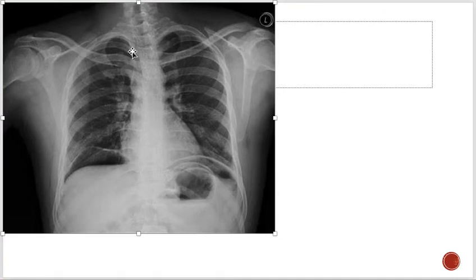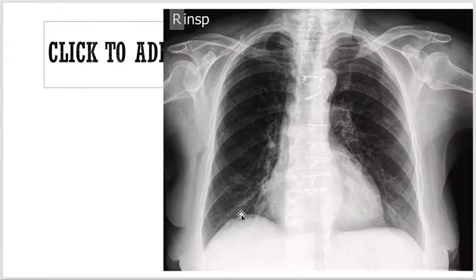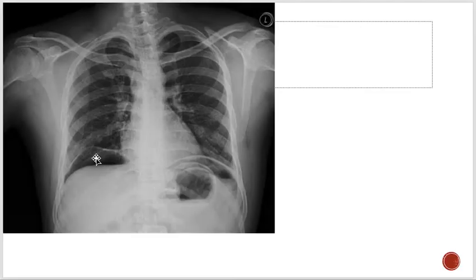Now, see, when I'm going to look at the X-ray, what I am finding, like when I am going to check the diaphragm, I can see this liver shadow. I can see this stomach, air in the stomach. But what I can see, like, what is this? Or this one? Normally, the diaphragm is completely attached with the liver. But here, what I can appreciate is there is gas under the diaphragm. This is a very, very, very important finding, guys.